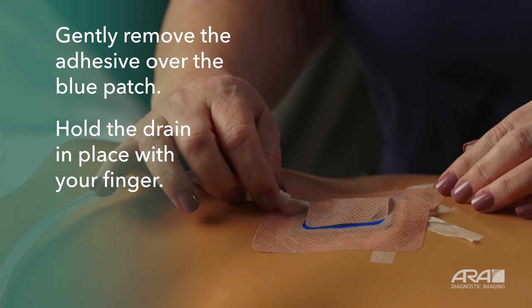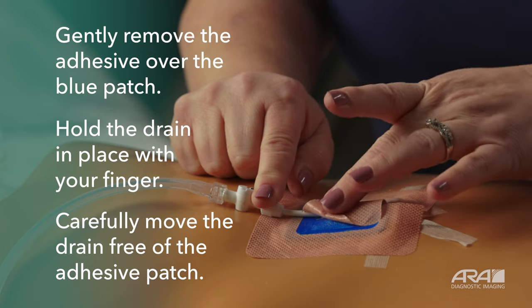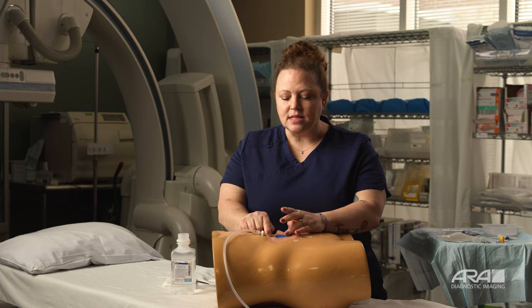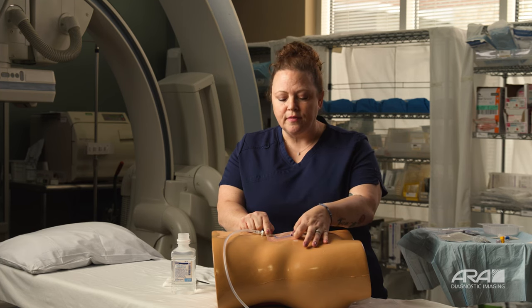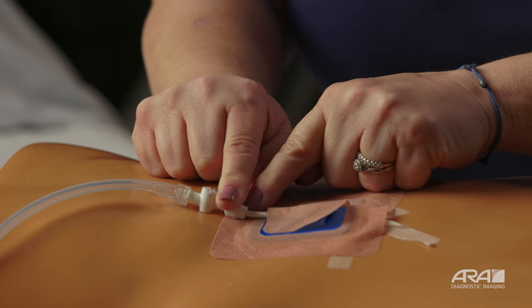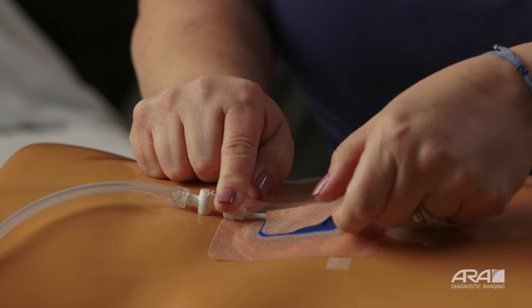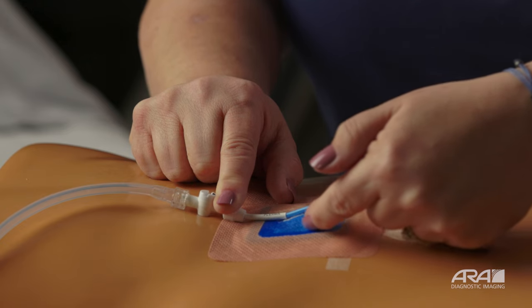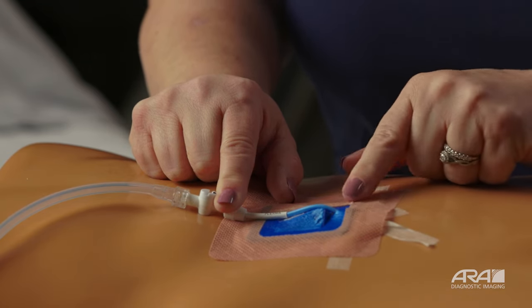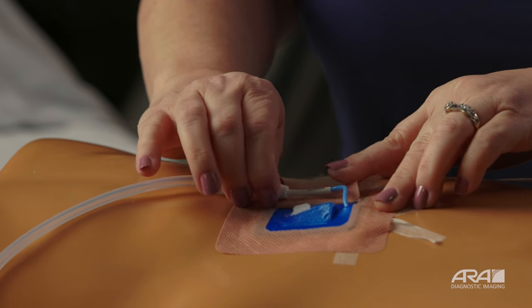To remove your dressing, hold your drain cap between your fingers — or with one finger on the drain cap — and start pulling back on the dressing that is over it. Keep in mind this can be very sticky. If you're having trouble pulling it up, don't struggle. Use an alcohol prep pad or dampen it so that you can pull it back a little easier. When you pull this back, make sure your finger is holding your drain in place. You'll notice there is a small length of drain outside of your body. Pull back the outer layer to expose that small piece of catheter. The blue surface it rests on is also very sticky, so keep your hand on your drain and pull back until it is free of the dressing.